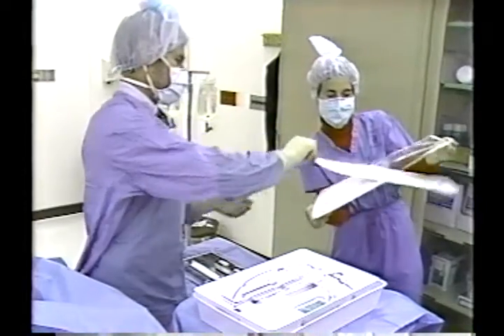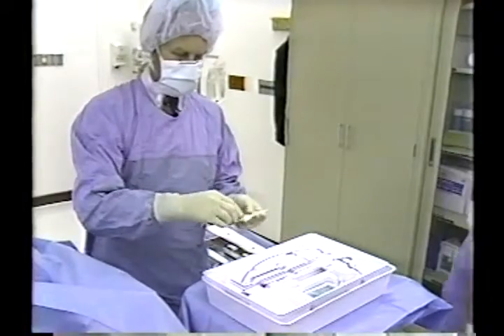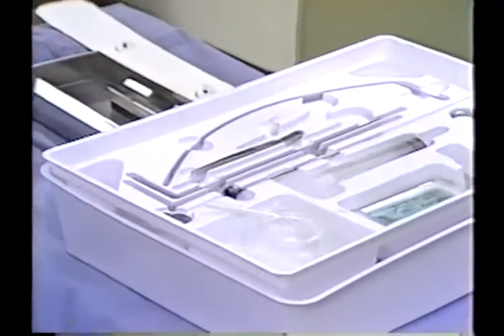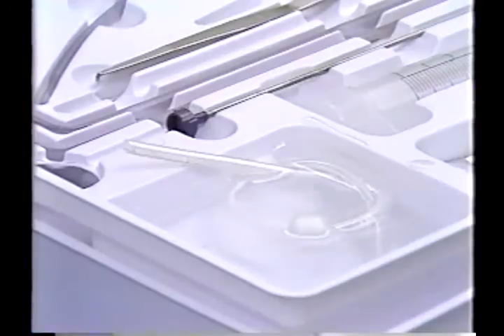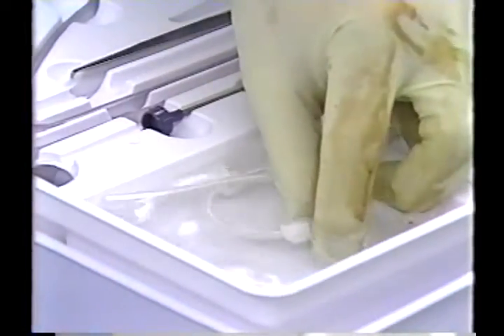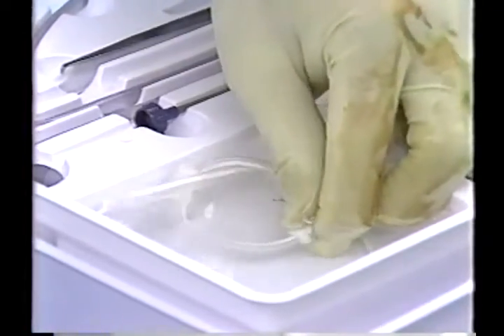The catheter pouch is opened and the catheter removed. The catheter is then rinsed in sterile saline. The cuffs are submerged and squeezed so that the air trapped in the cuff material is removed.